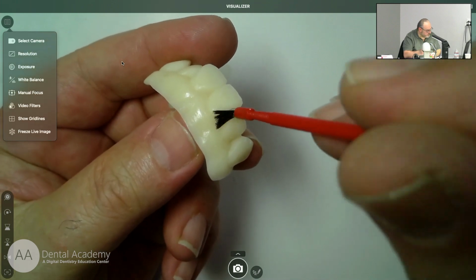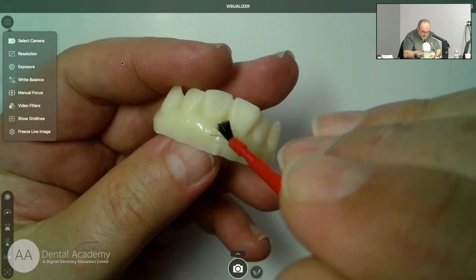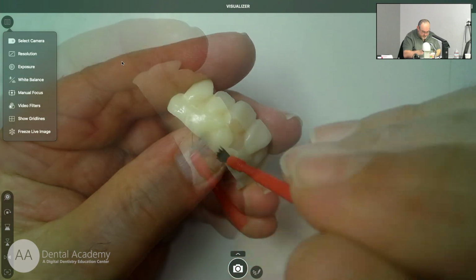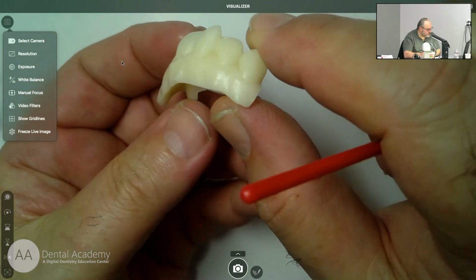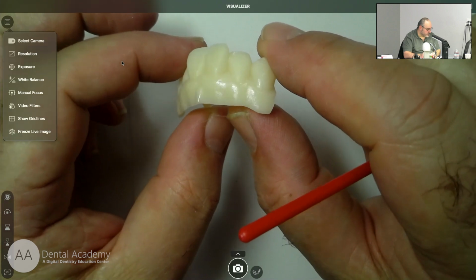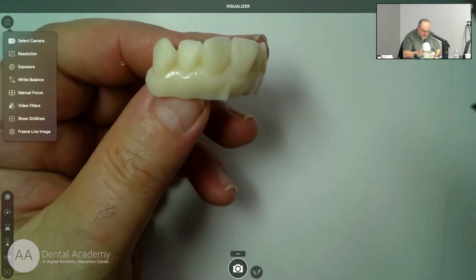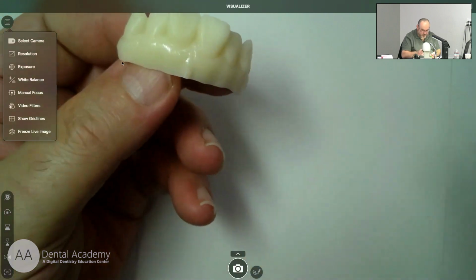And put the primer in between the teeth, because you're going to put composite there too. Okay, so look at it. One drop, 1 or 2 drops will cover the whole thing. Okay, so you don't need to put too much. So once I put this primer on, what I'm going to do is I'm going to tack cure it for 10 seconds.